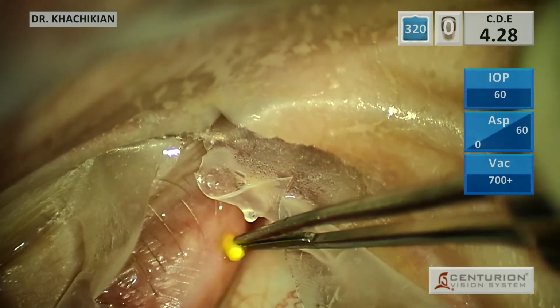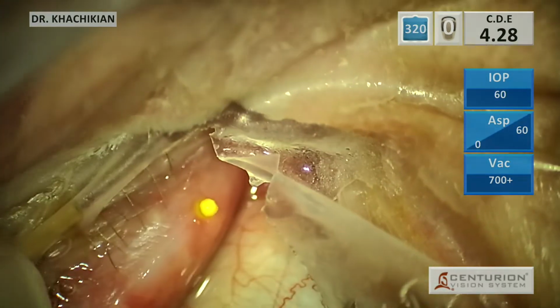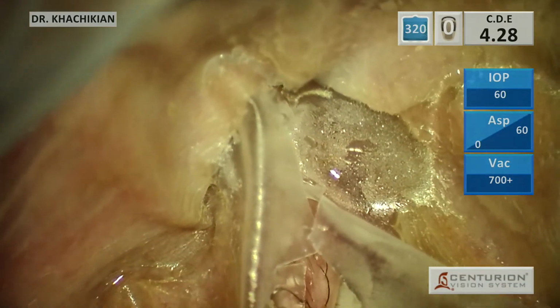And if this is the case, I will typically give it a few tries and then transition to a 0.12 forceps, which can get a better grasp of the Dextenza. Grab it and shove it in, and there it goes. And if you have dilated well enough, it goes in fairly easily, and the case is over.